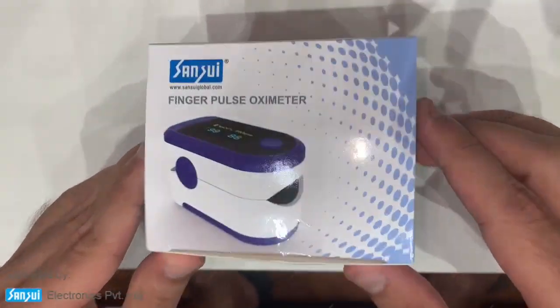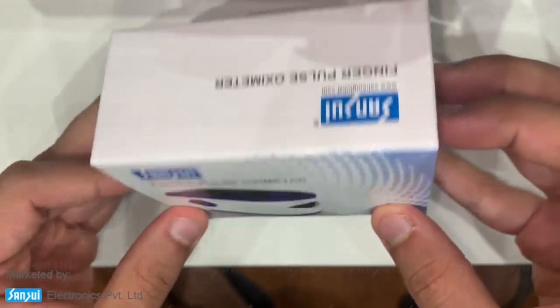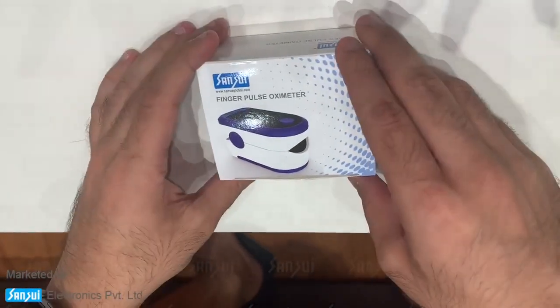This is the Sansui fingertip pulse oximeter in blue color. I'm going to do an unboxing video for it.